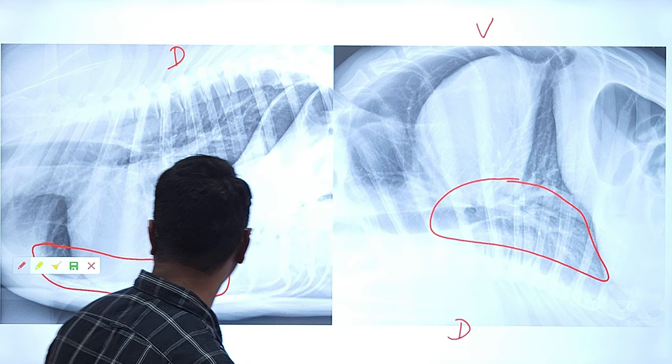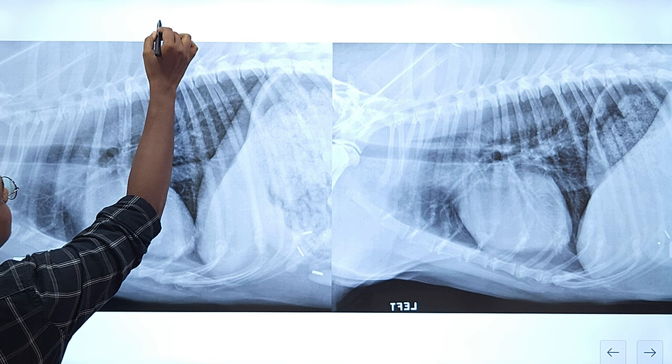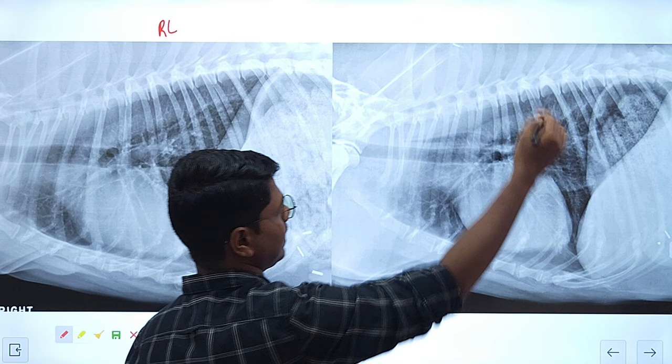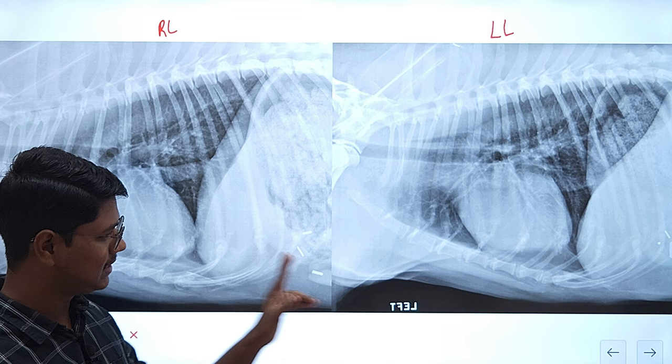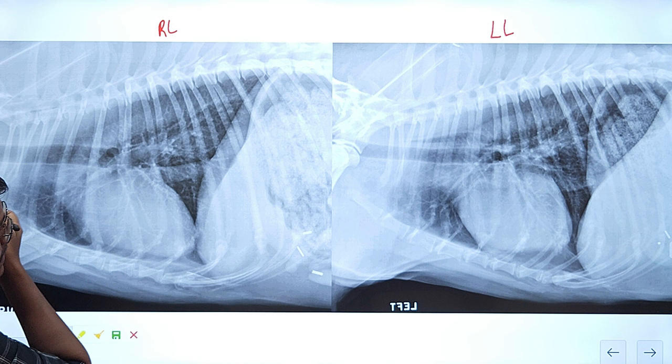Now we will go to our thoracic radiograph. This is the lateral radiograph — this one is right lateral and this one is left lateral. I have a homework for you — while watching, I will tell the differences between the right lateral and left lateral and how to differentiate them. Note them down and comment in the comment box how much you have grasped. First we will see the lungs.